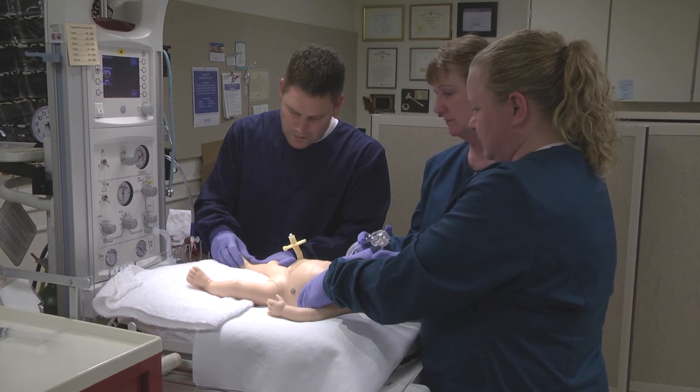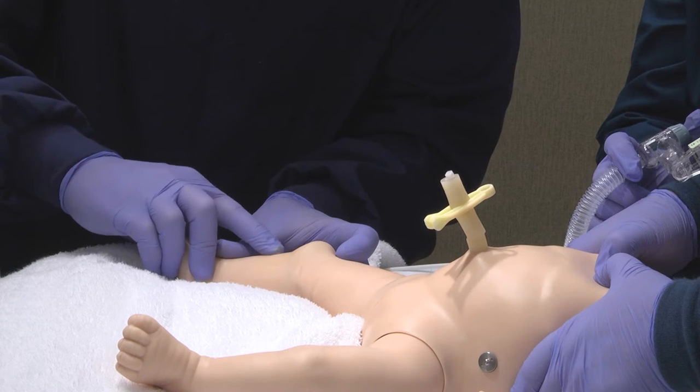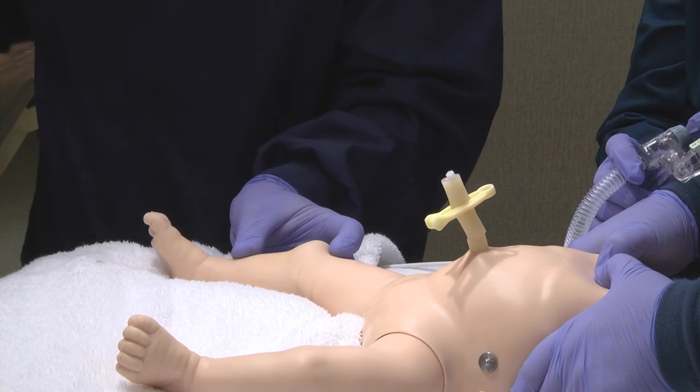Identify the insertion site. For term newborns, the preferred site is the flat surface of the lower leg, approximately 2 cm below and 1–2 cm medial to the tibial tuberosity.